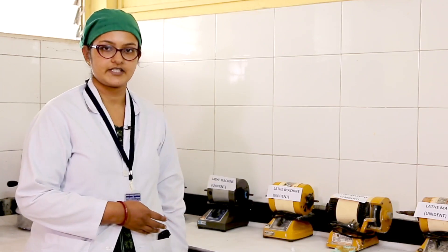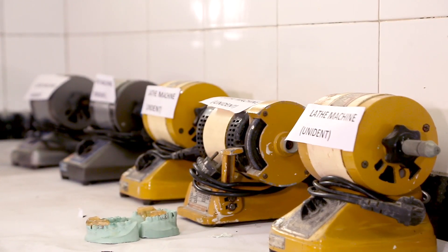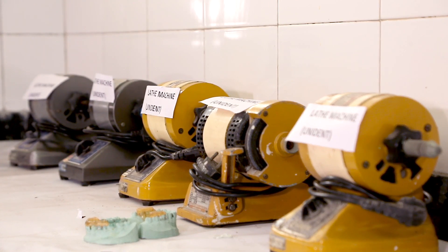These are lathe machines where acrylic appliances made by our students are trimmed and polished.